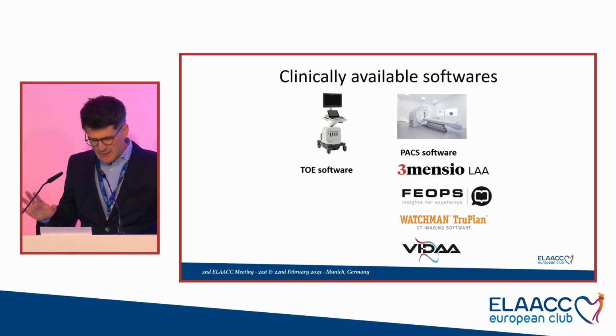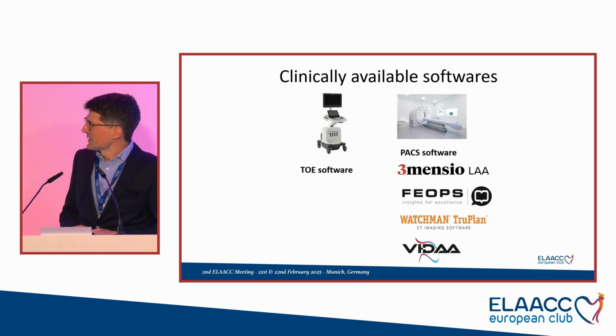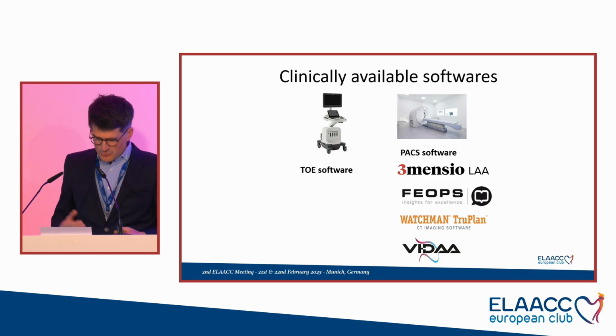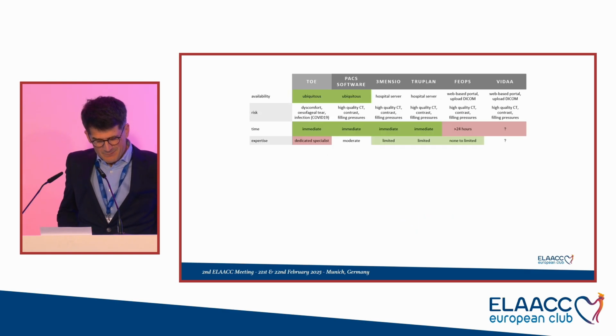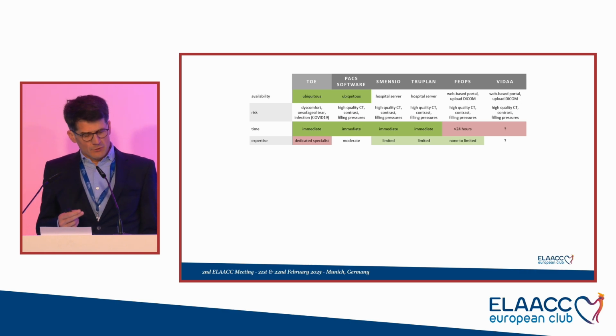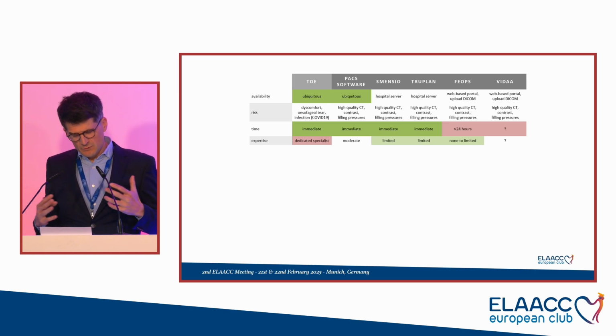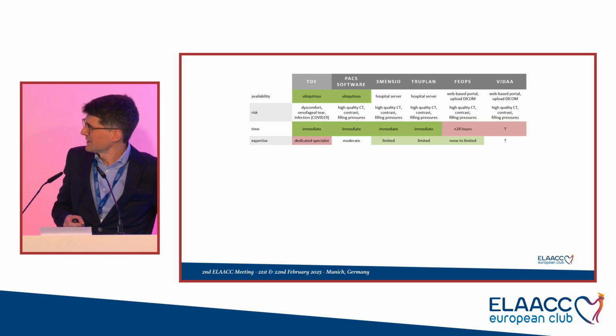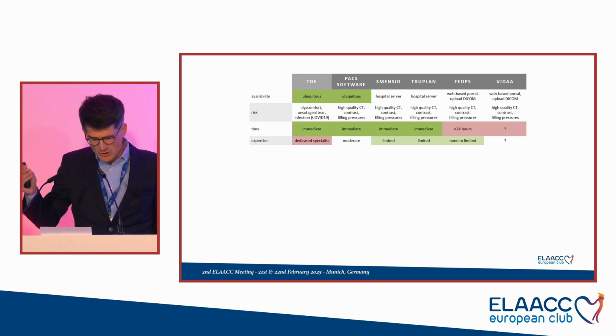We have two kinds of software that we could use, either based on the TOE imaging or based on the CT. And then you have different post-processing of the CT. The advantage of TOE and of the software that's running on your hospital PACS is that it's easily available, while other software have to be installed on your server, but you also have FEOPS and VIDA, where you have to submit your case, you have to upload.